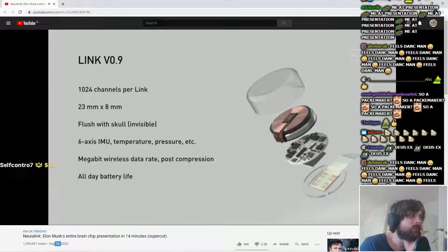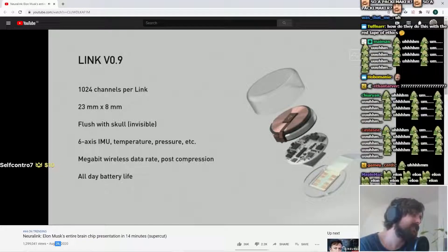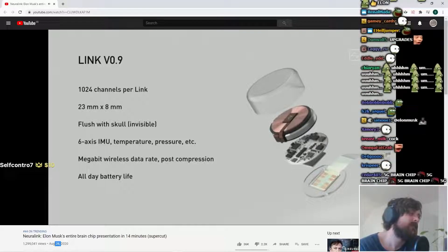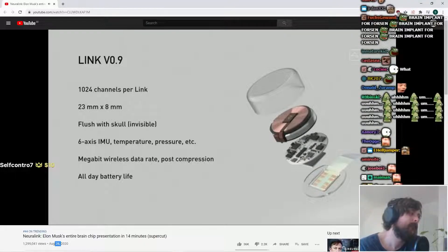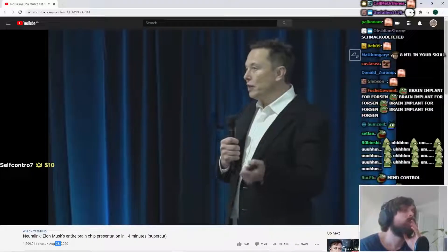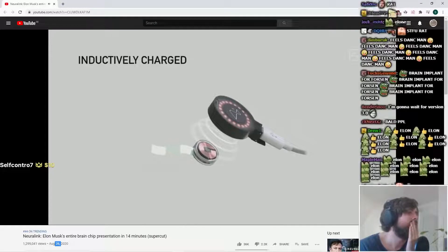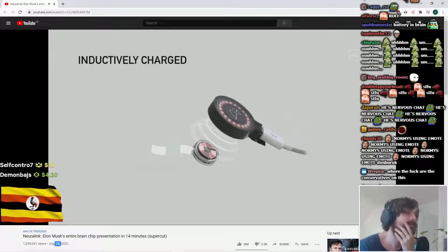It's 23 millimeters by 8 millimeters and fits quite nicely in your skull. It goes flush with your skull — it's invisible. All you can see afterwards is a tiny scar, and it's under your hair; you can't see it at all. It's also inductively charged, in the same way that you charge a smartwatch or a phone. So you can use it all day, charge it at night, and have full functionality.